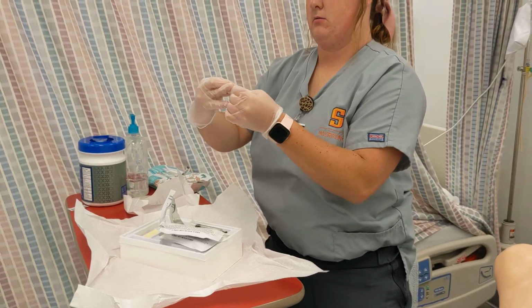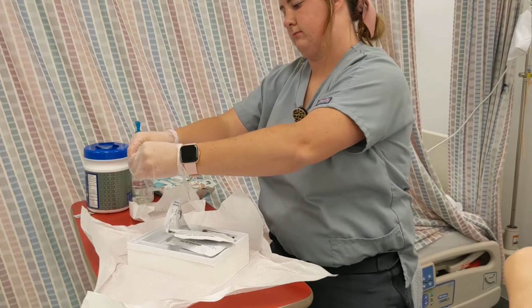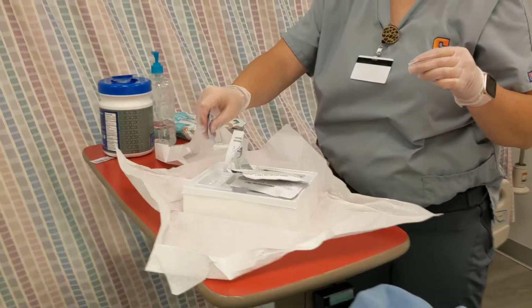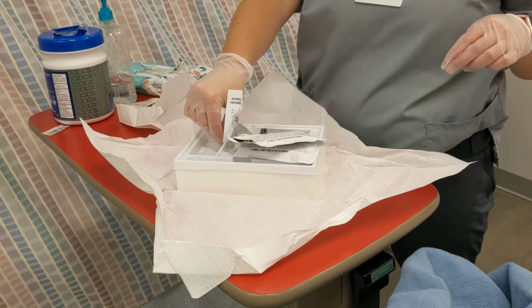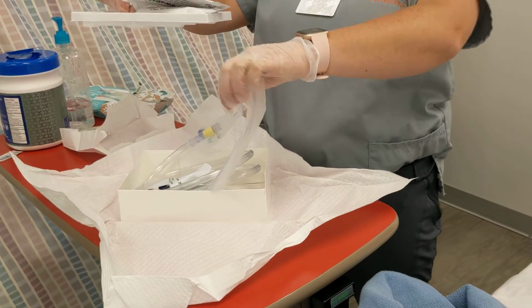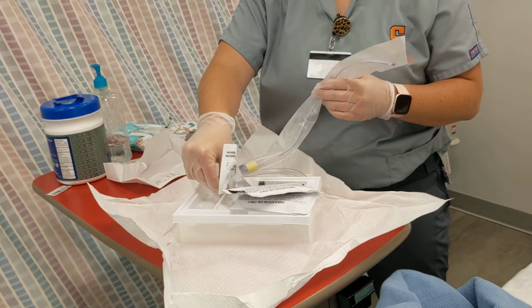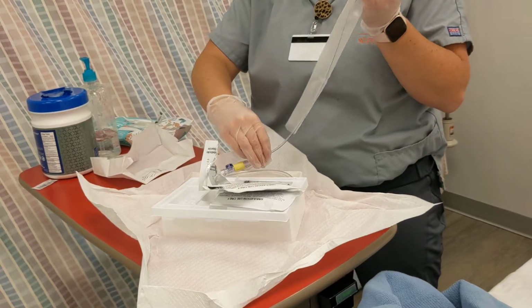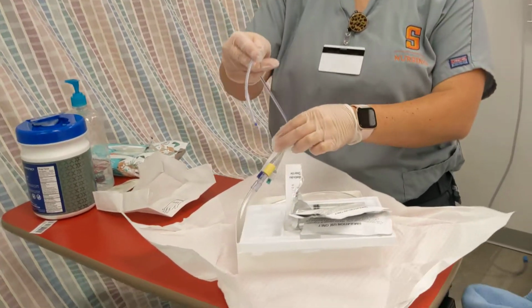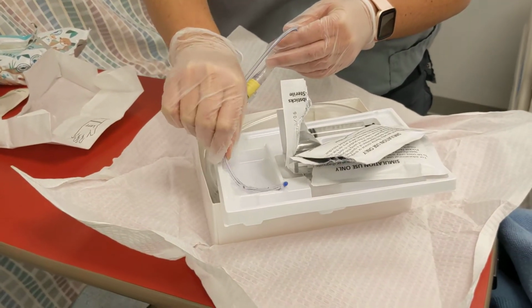Dump my lube out. Okay, now I'm going to lubricate 2 to 4 inches of the end of my catheter.